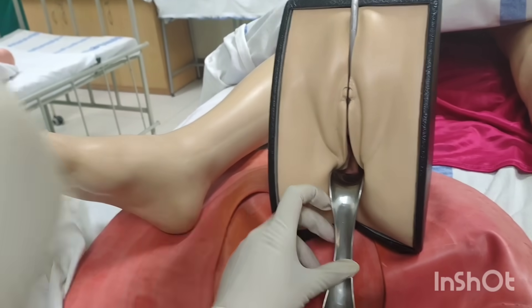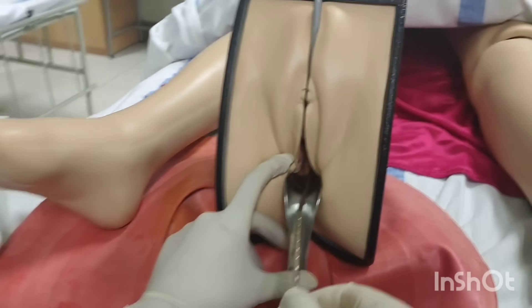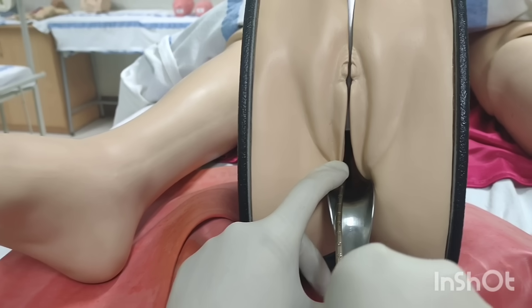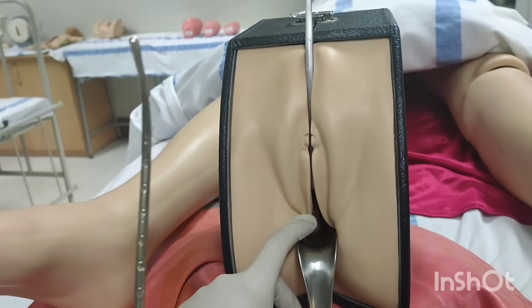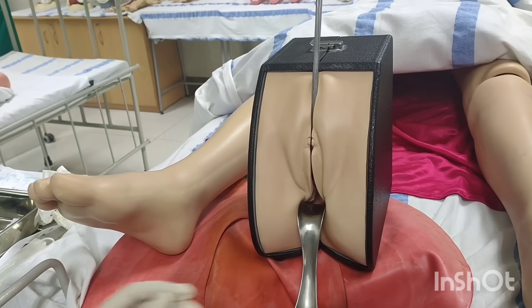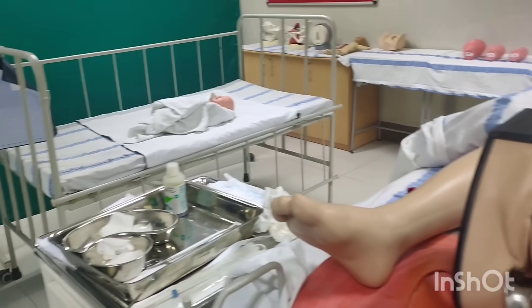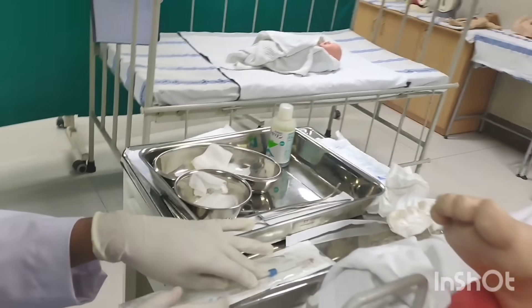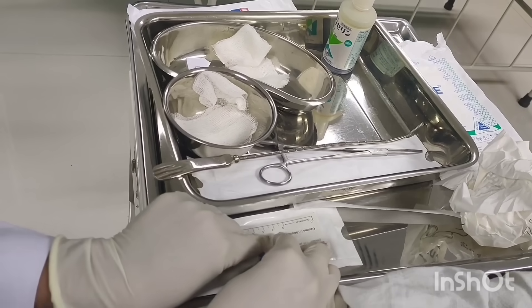You have to take this uterine sound and take it into the uterus, measure the resistance where it is felt, move it outside, and mark the size. According to that size — for example 7 cm — you have to measure and, on your copper T, fix that size by moving this stopper.